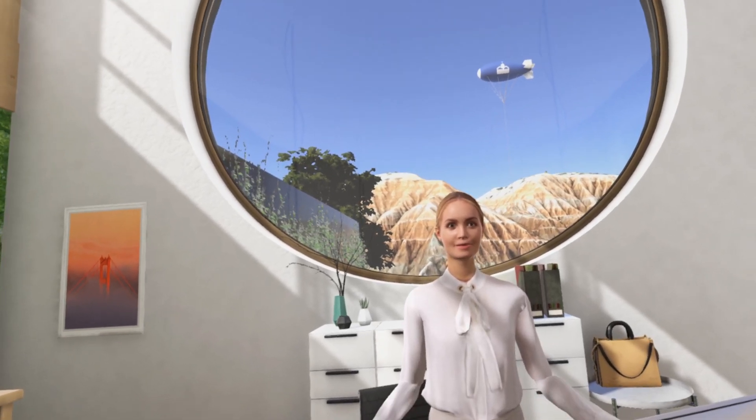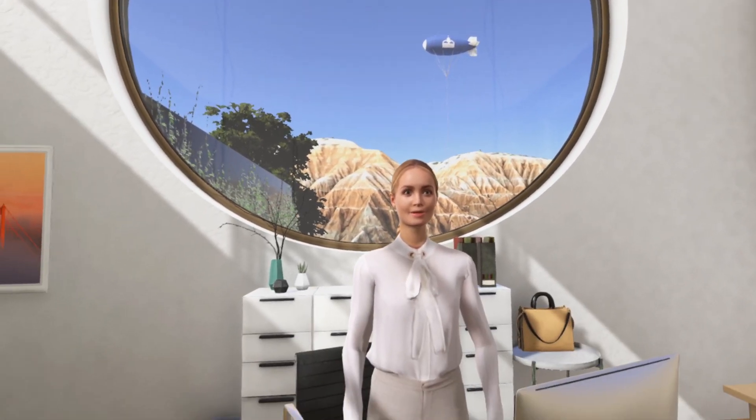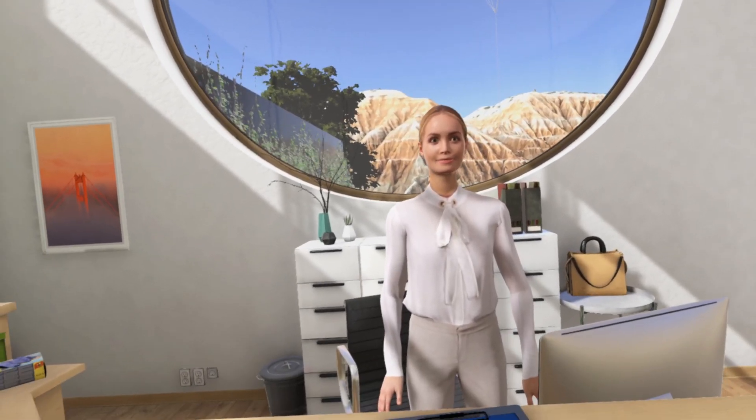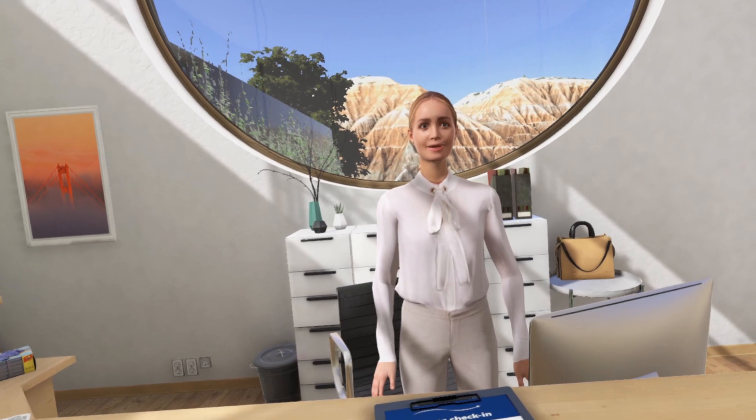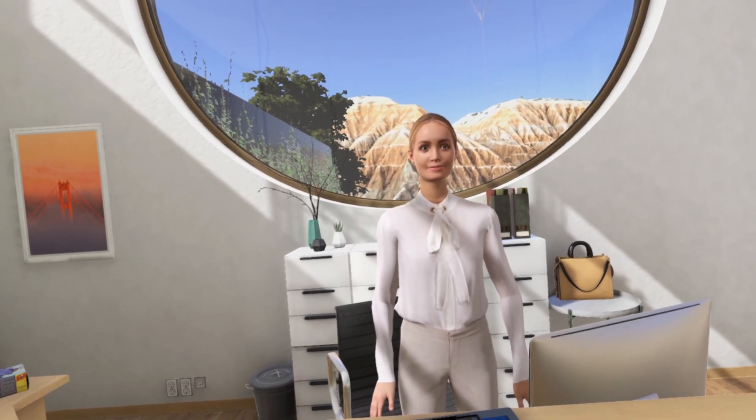Hi there! Welcome to Lifelike's Dialysis Education Center. You're a new trainee and we've been expecting you.